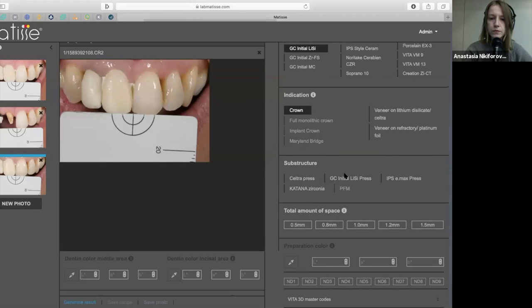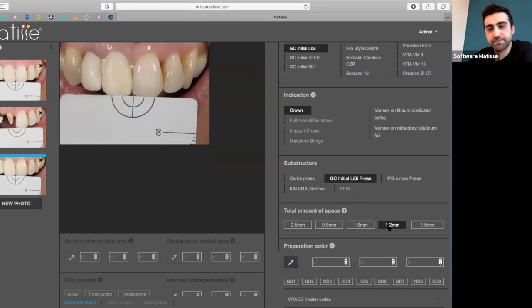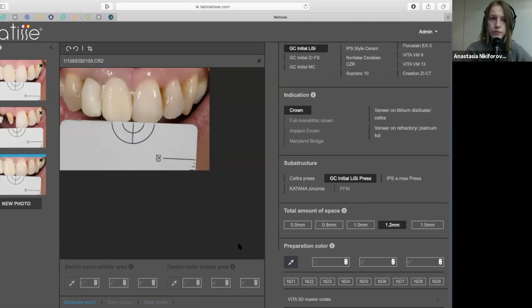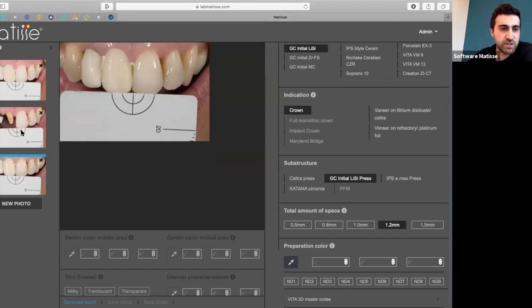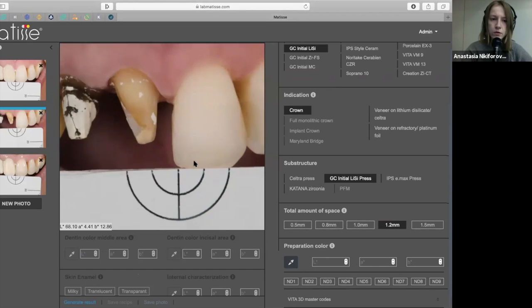So we choose the substructure material that we want to use. Then the total amount of space, the thickness of the restoration. I have to measure the preparation color, so I switch to the second image.